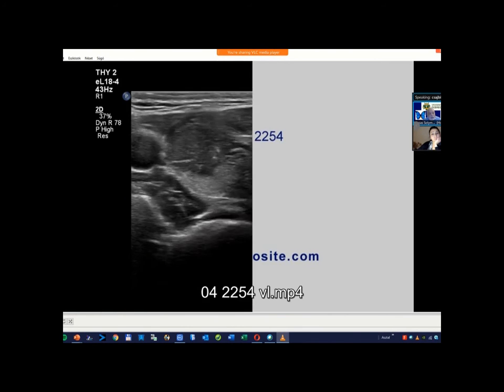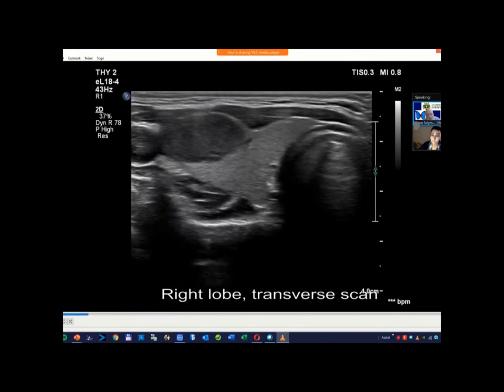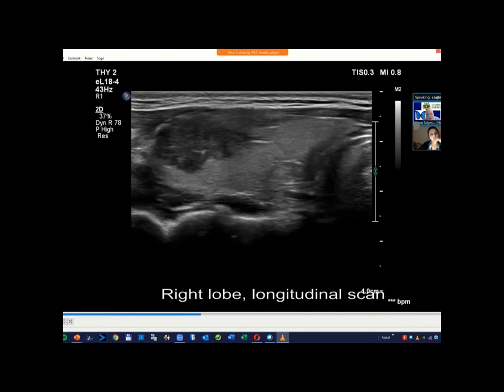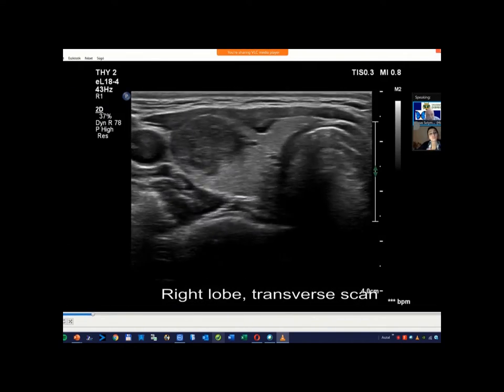The third feature regards the possibility of extrathyroidal spread. Here is a sign of capsule, and again here. But a great proportion of the nodule is not covered by capsule — a great proportion of the thyroid where the nodule is adjacent lacks capsule. So this capsule is clearly discontinuous. This nodule bulges: the distance between the most ventral part of the thyroid and the most ventral part of the nodule is around 3 or 4 millimeters. This is clearly a bulging nodule very close to the edge of the thyroid. The third sign, abutting contours, can also be observed. So this nodule presents all three possible signs of a possible extrathyroidal spread.